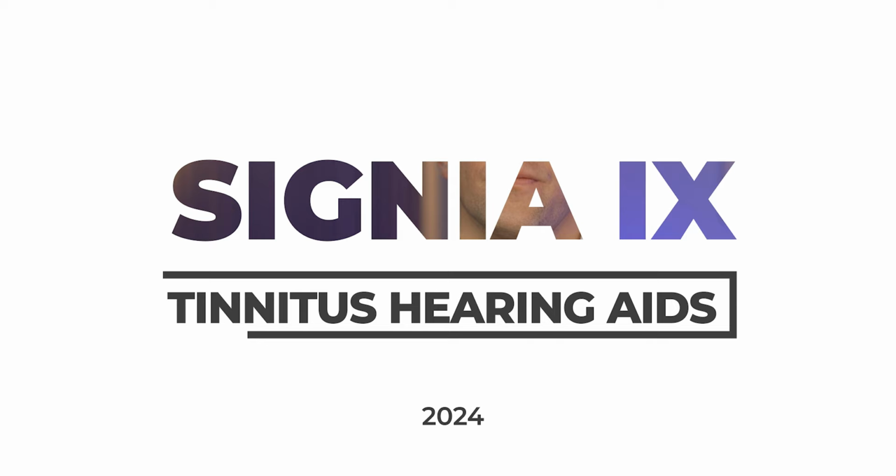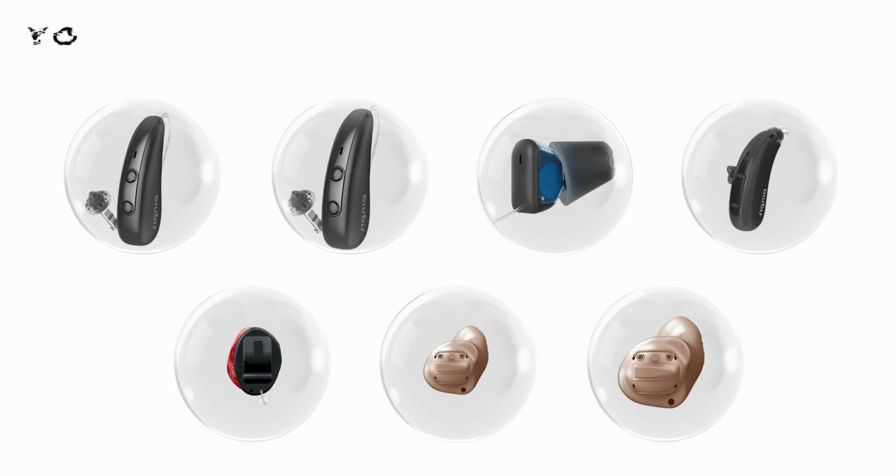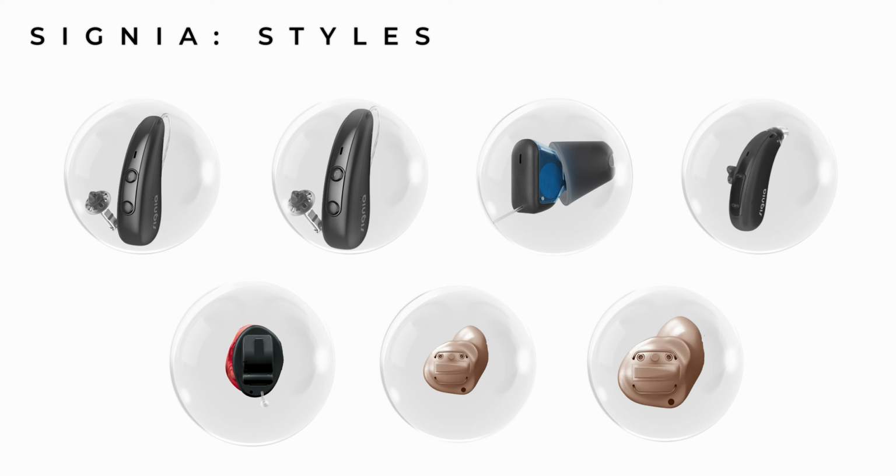Now, I think it's great that Signia's tinnitus therapy features are available in all the styles, although you do have to take a step back in technology for you to be able to access some of them. For example, it's available in their Pure Charge&Go IX, their Pure Charge&Go TIX, and their Silk IX, which are their most up-to-date family of hearing aids, plus their Motion BTE hearing aids and the Insio NX IIC, CIC, and ITE, which are older technologies.